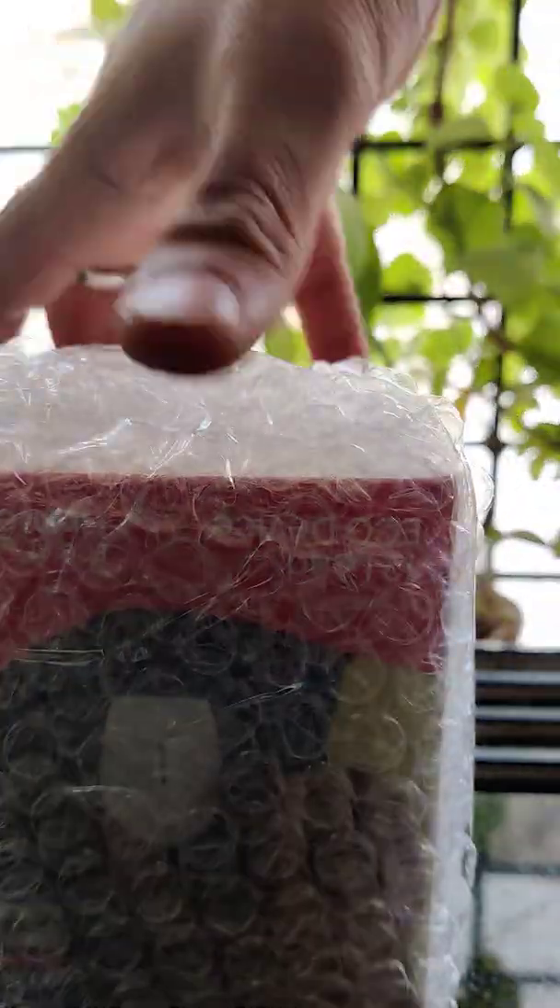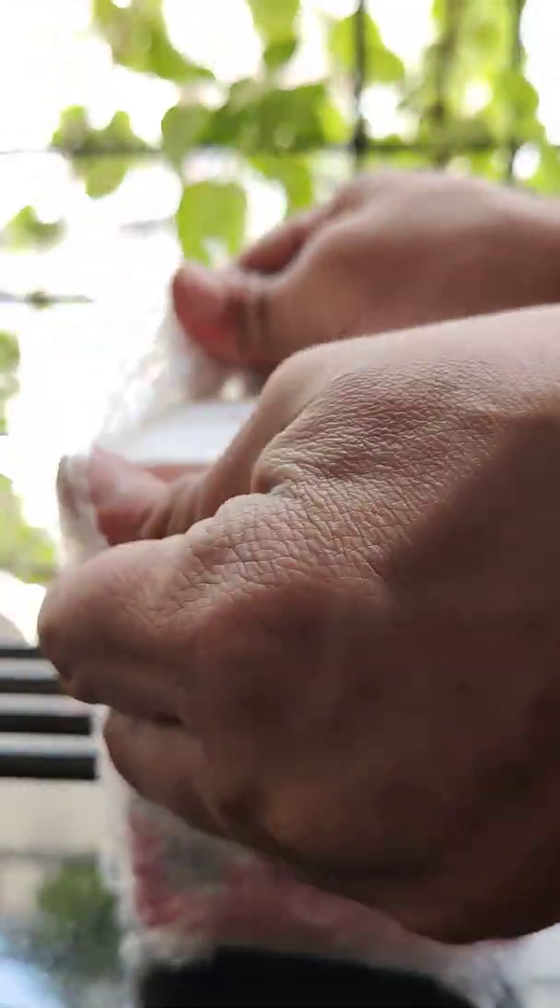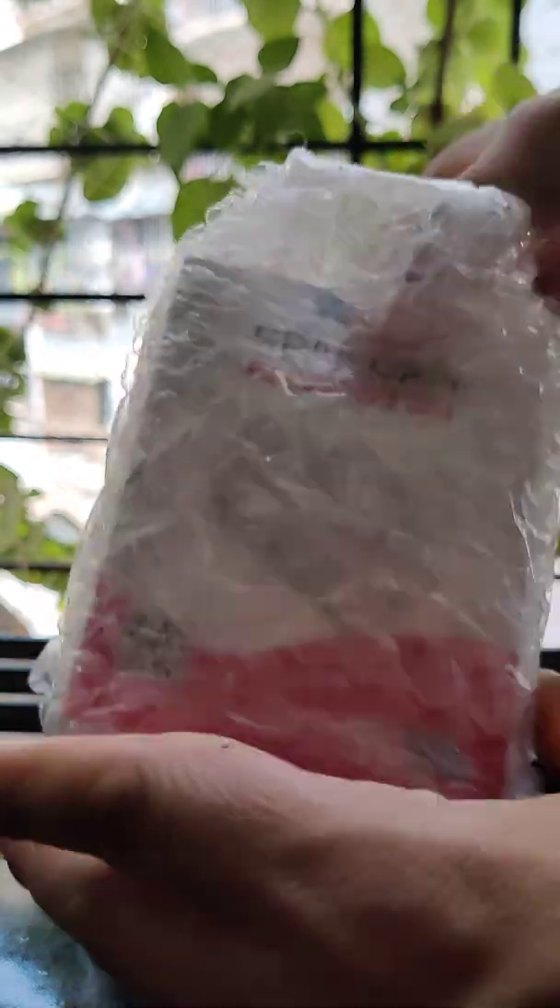So here we can see it is all packed in bubble wrap, and the device is inside this bubble wrap. Let's quickly try to tear through it and get our device out.